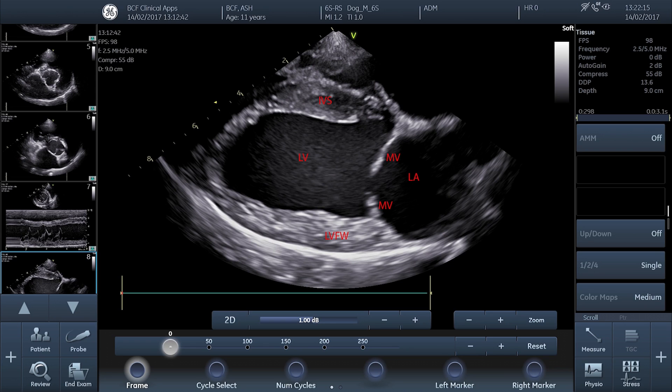We've also tried to tweak the view such that we don't have any papillary muscle visible in the image. You'll note that you tend to catch a bit of papillary muscle that creeps in on the left ventricular free wall or posterior wall towards the bottom of the image, so just make sure you try to avoid that where at all possible. You also need to be able to see the left ventricle along its entire length, including the apex. If this means cutting off some of the left atrium, don't worry — that's fine, as we're just specifically interested in the left ventricle.